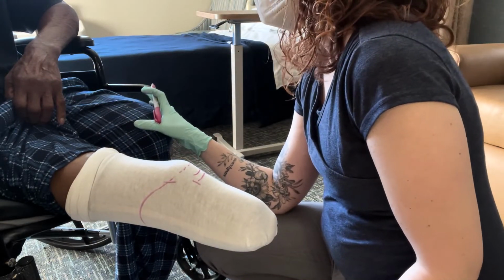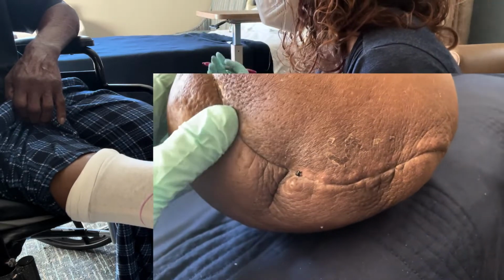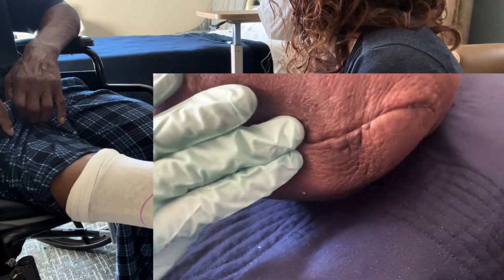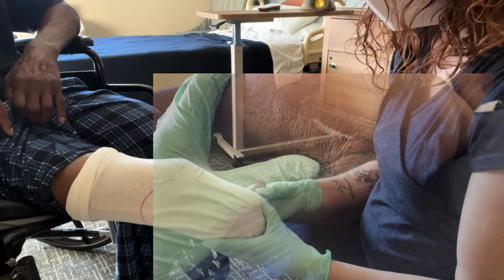And how long ago was this surgery? About 2 months. So you're still pretty early out from surgery on this side. Yes. So it takes a while. Even though it looks good on the outside, it takes a while for that underlying tissue to heal up.